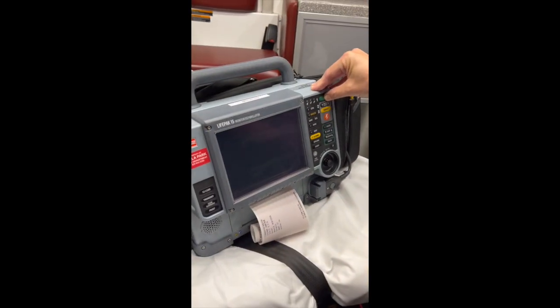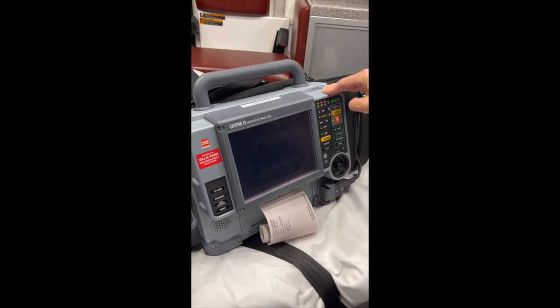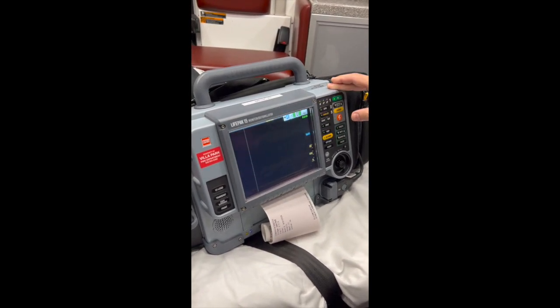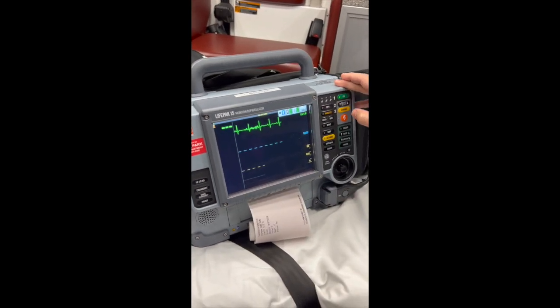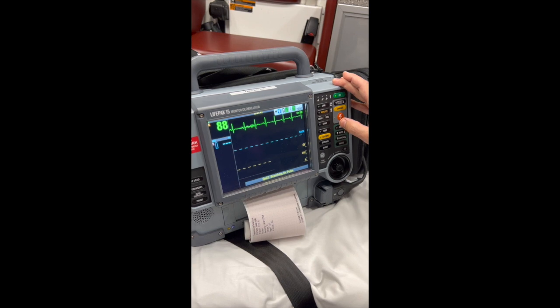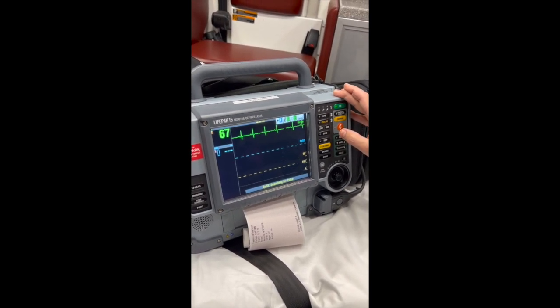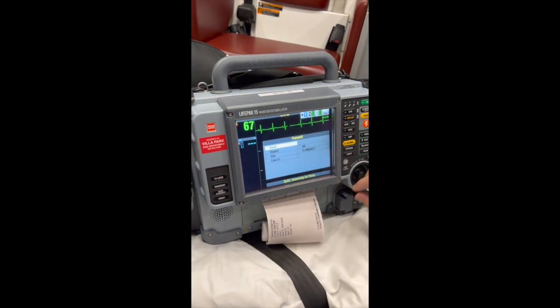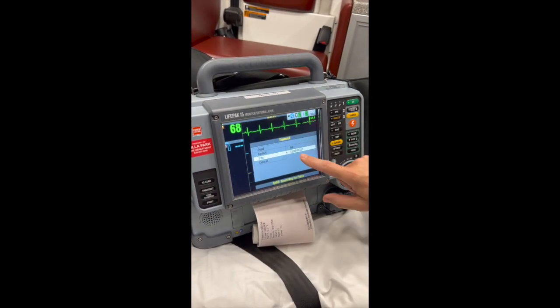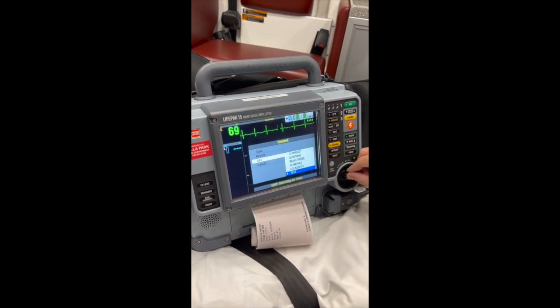If you think there's an issue with the sending and your Wi-Fi is good, there is a way to test the connection to find out if the problem is on the monitor side or on either the hospital or ImageTrend side. So if you go to transmit and you go to site, we'll send all, but we change the site to a test site.